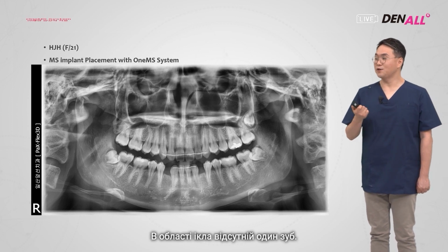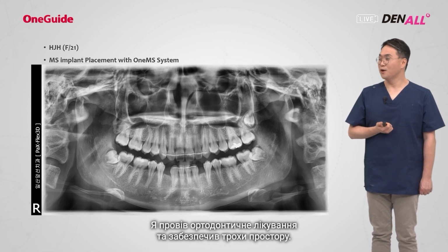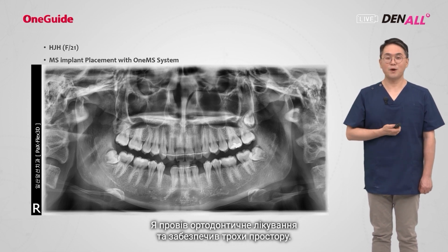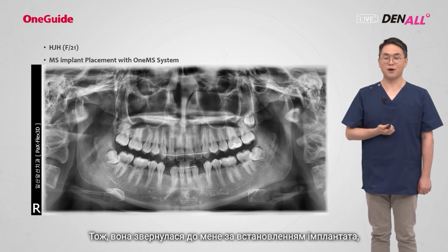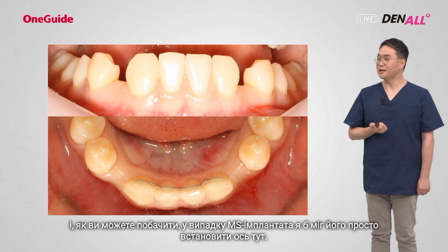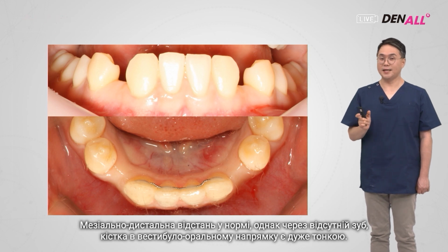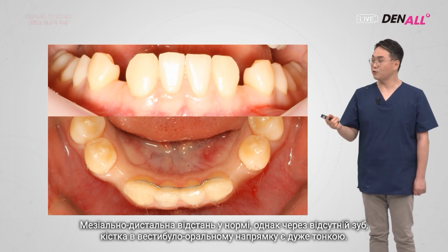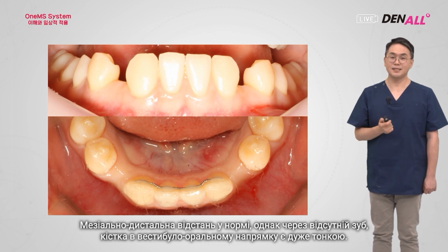21-year-old female. On the canine side, there's a missing tooth, so orthodontic treatment was done and space was secured. She came to me to have an implant. As you can see, with the MS implant, you could say I could just place it, but the mesial-distal distance might be okay, while the buccolingual side was very thin because of the missing tooth.